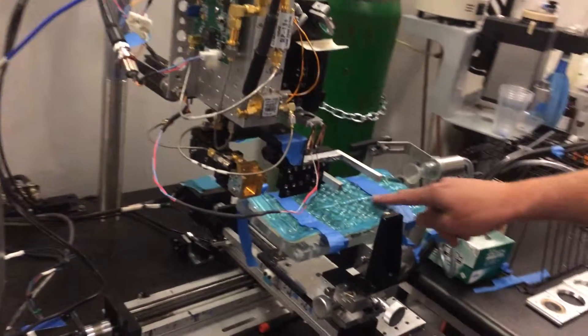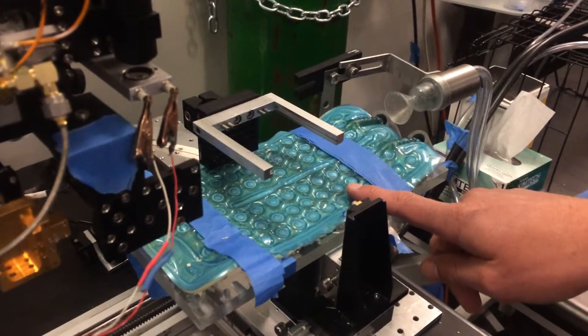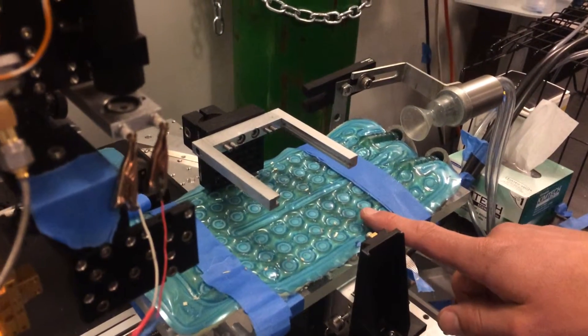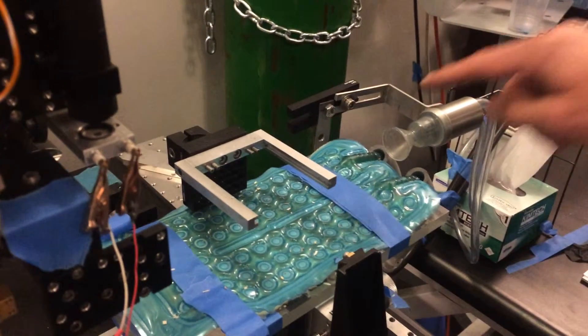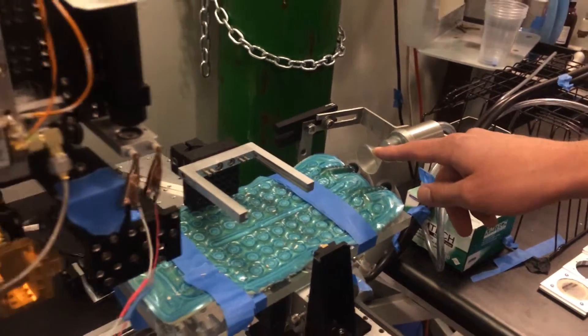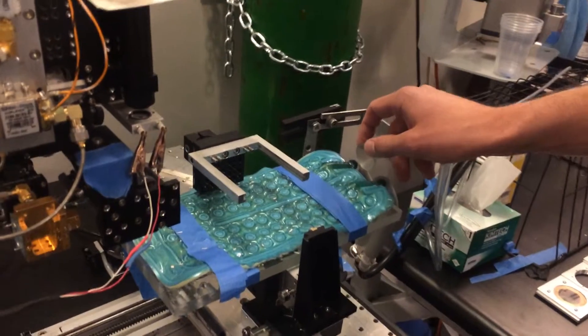The rat sits here. This is the heating pad to keep it warm because it's anesthetized, so it's asleep. And once it's asleep, it can't regulate its body temperature as well, so you have to keep it warm. Nose cone for general gas anesthesia. We keep this thing knocked out the entire time while we're imaging.